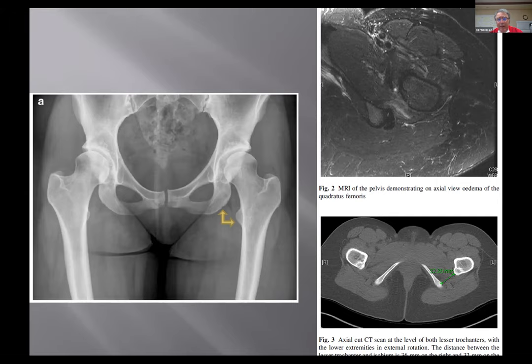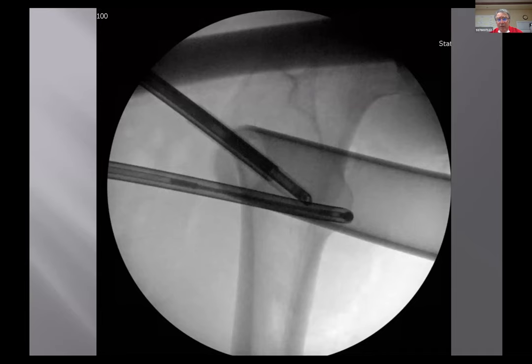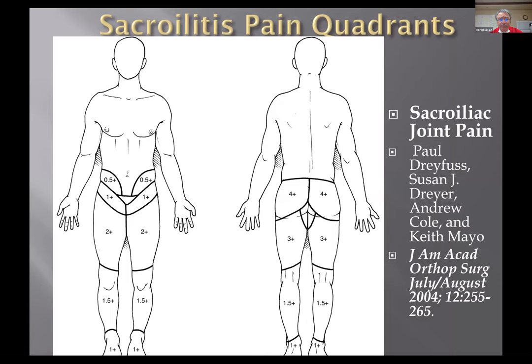So another thing we look at when we do our anterior hips, our total hips, is we look at our offset. And our offset on our femoral stems can be varied based on the type of implant we place, and that helps us recreate what's normal. By the way, this girl on the left has a pretty dysplastic hip. See how shallow that looks? Very narrow center edge angle. If you draw a line straight up the middle of the femoral head, there isn't much roof on this person. So I kind of shy away from these people. You can go in and take away some of the prominence from the lesser troch.